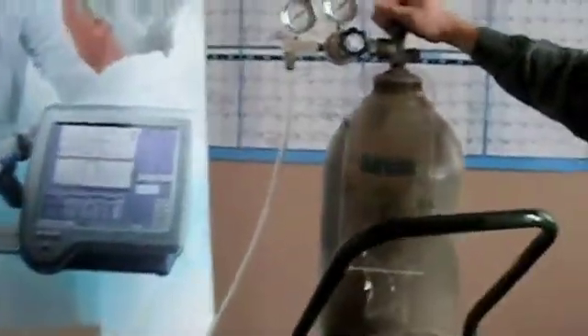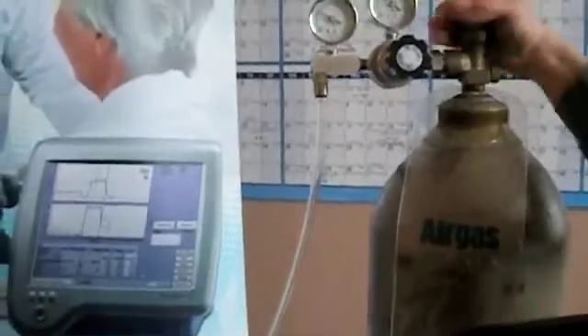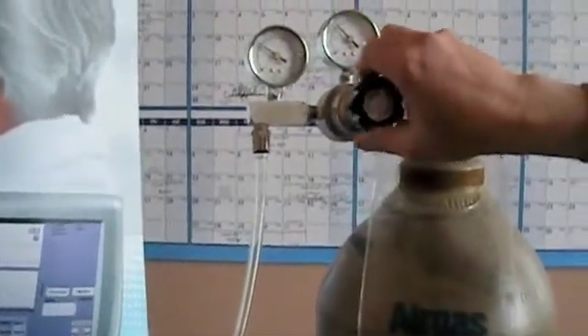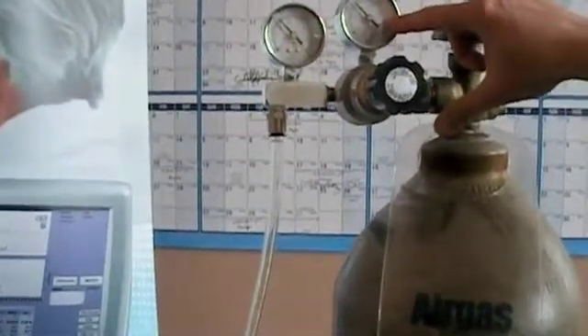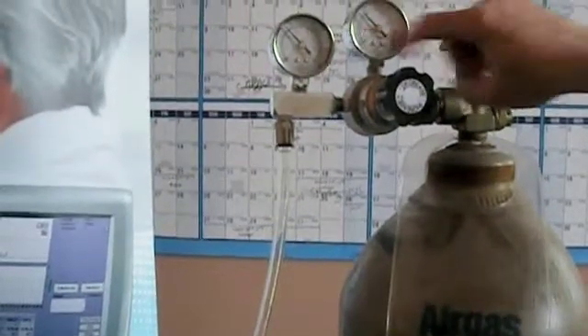Then we want to make the adjustment, opening the valve on the tank completely. And then we want to increase the regulated pressure to 70 PSI, which is right here. You want to make sure that the bottle always has a PSI greater than 500, which is right here.